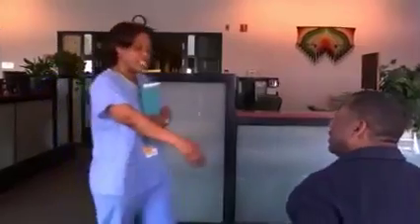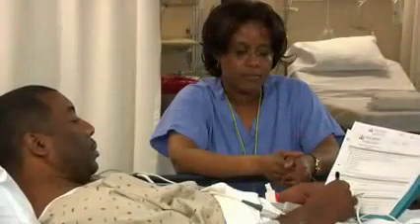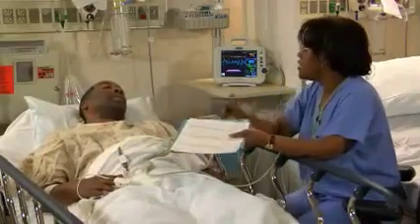Any food in your stomach will block the view through the endoscope, and the food could cause you to vomit during the procedure. An upper GI endoscopy can be done in either a hospital or your doctor's office. In either situation, you'll be asked to sign a form verifying that you consent to having the procedure and that you understand what's involved. If there's anything you don't understand, ask a member of your medical team for more information.